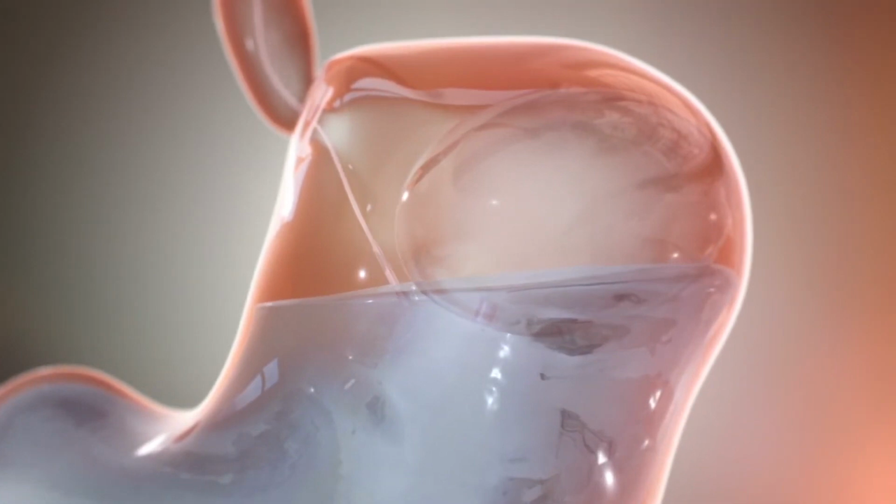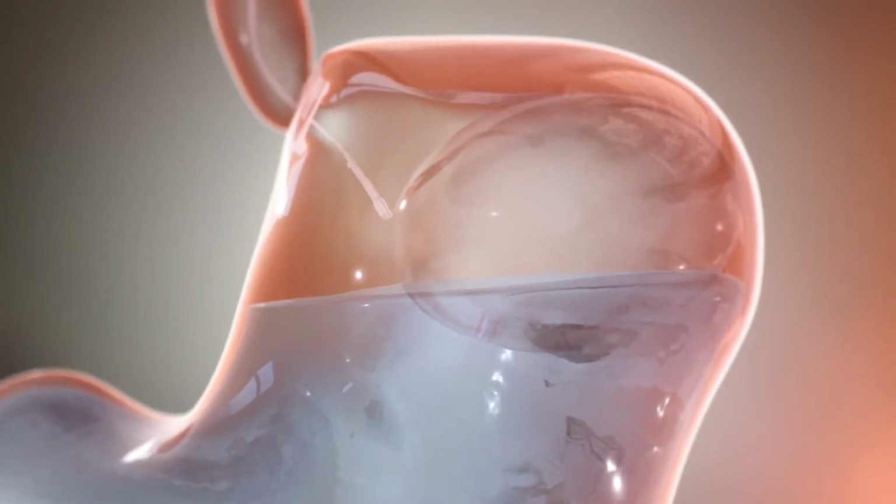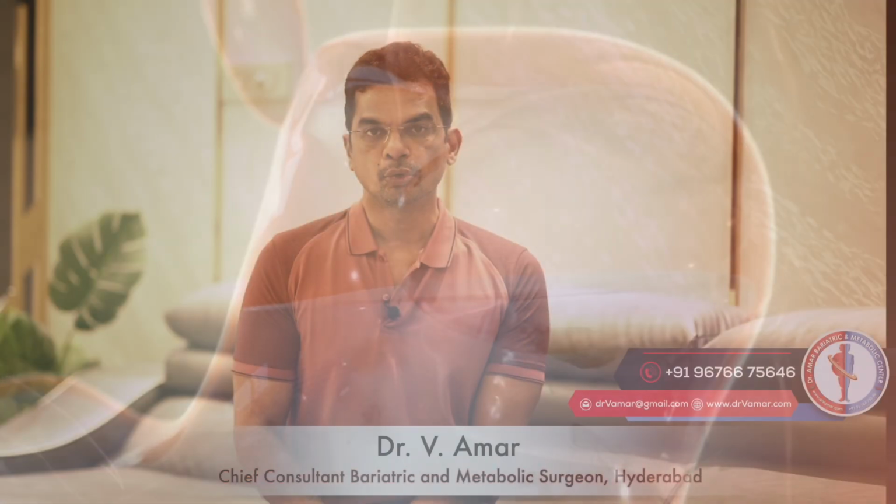It is true that anesthesia or sedation is not required for this balloon insertion, but what about radiation? Fluoroscopy is equal to 75 to 3000 chest x-rays. That means to introduce a balloon, you are exposing the patient to unnecessary radiation. This is not revealed by these companies. Fluoroscopy has a risk of radiation, and they won't talk about that. And no surgery is required.